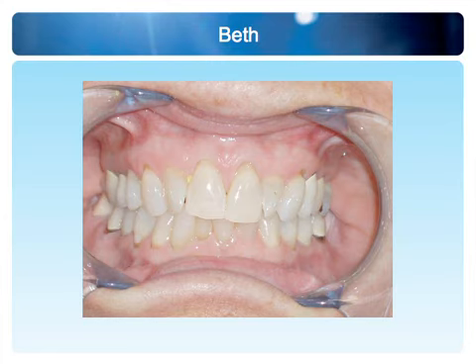We can see recession over here. This happens to be a 62-year-old female. So we would expect to see some amount of recession, and she certainly shows areas of it. But when we look at a case like this, we know right away from this photograph we won't really have proclining. That's an advantage. So with proclining out of the picture, we're down to expanding and also IPR. Those are two nice choices.